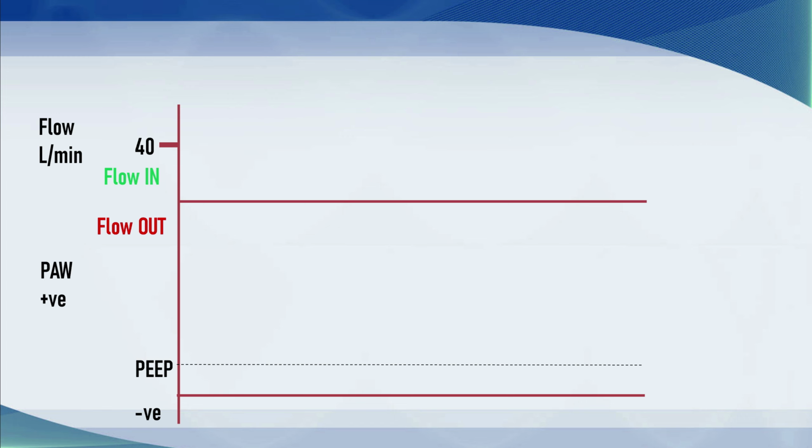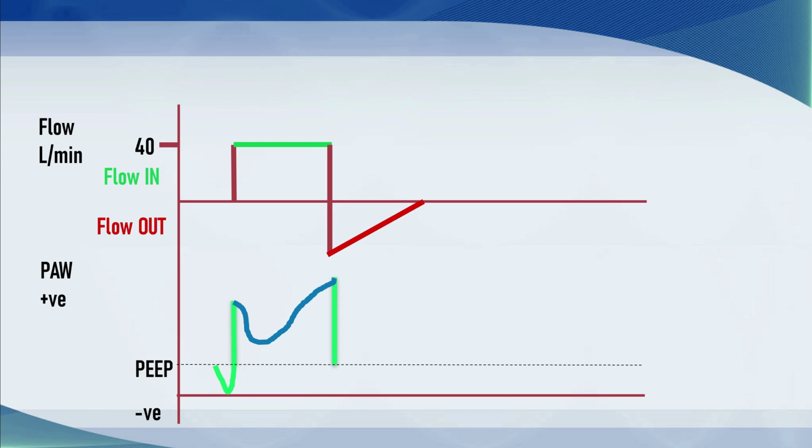The other major problem that you may encounter is demonstrated in this picture. What's wrong here? Well, you can see that this is volume assist control ventilation, and you'll note that there are 2 anomalies with the pressure waveform. The first is that the negative pressure deflection, the divot, goes almost down to atmospheric pressure during the triggering part of the breath. So the patient is taking a huge negative breath.